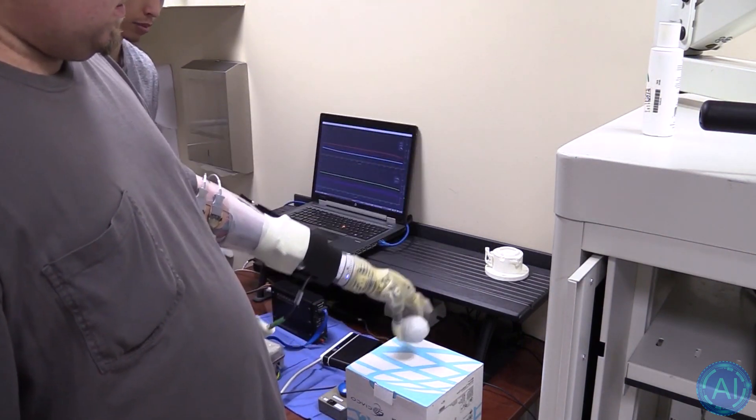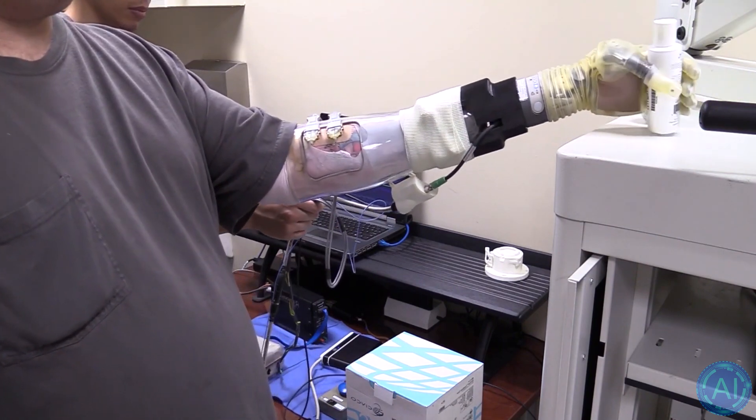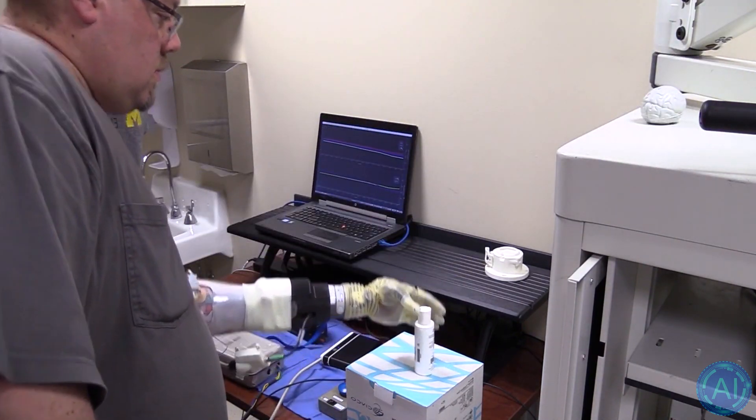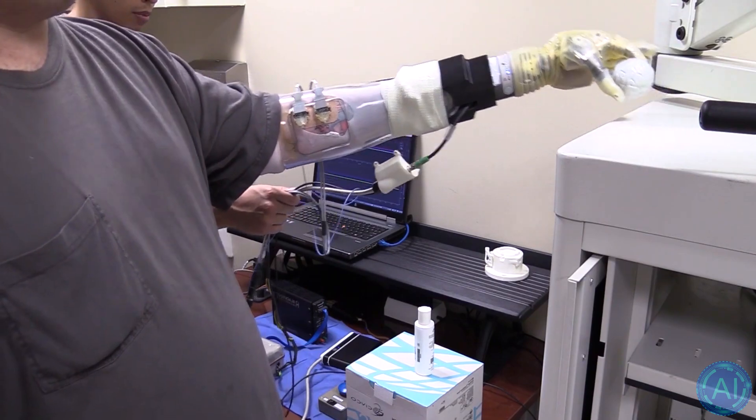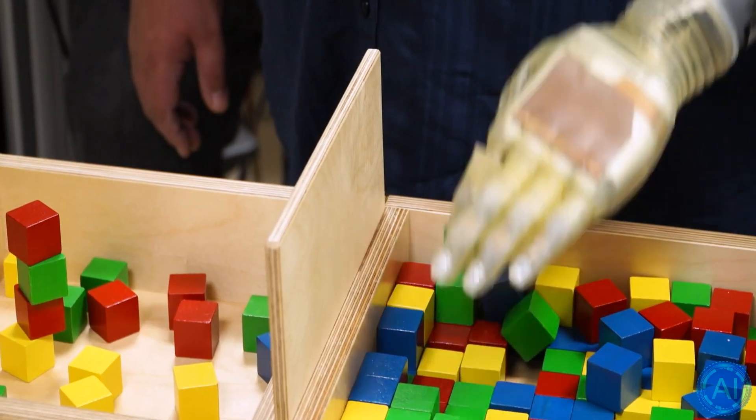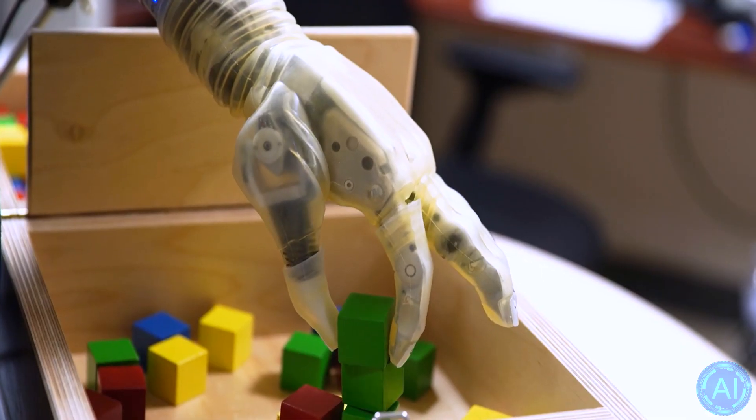One disadvantage this hand has towards the previous bionic limb is that it doesn't provide sensory feedback back to the user. But this is likely just because it's not part of the research since there's no real physics barrier in the way of achieving that.